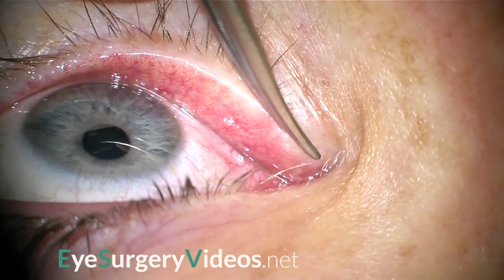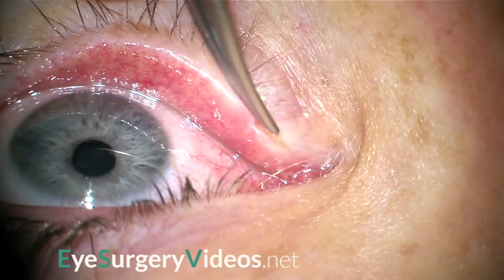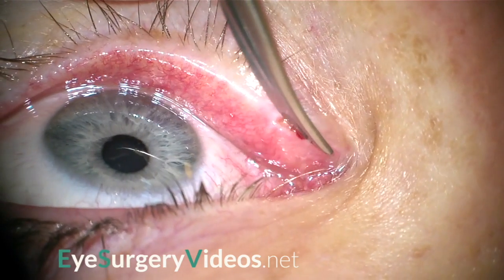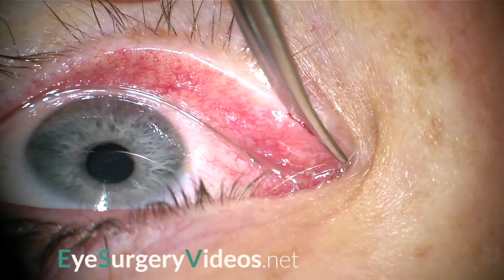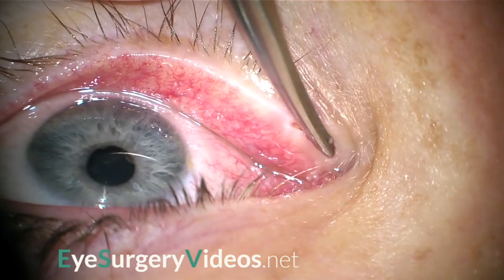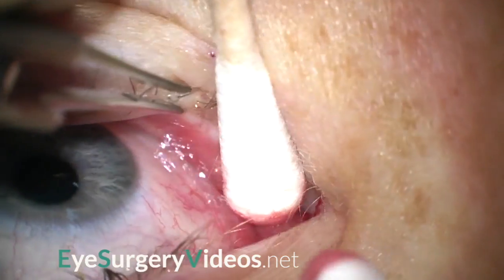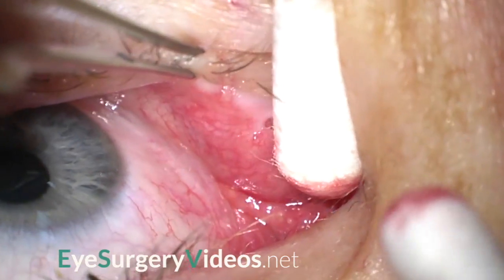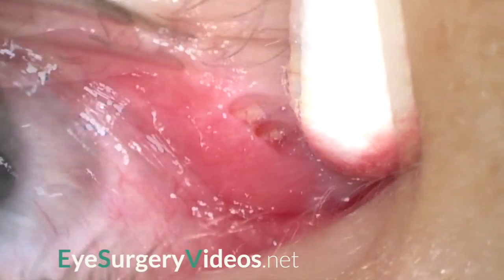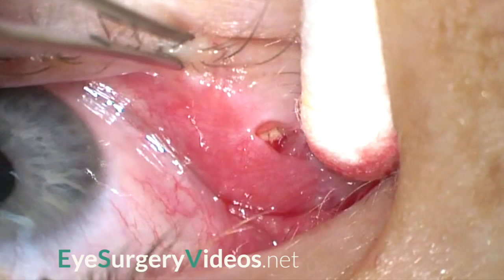A longitudinal cut is then made along the length of the inferior canaliculus to expose the epithelial lining. As the canaliculus is assessed, sulphur granules clearly come into view. These are also known as dacreoliths, canalicular casts, as well as concretions.